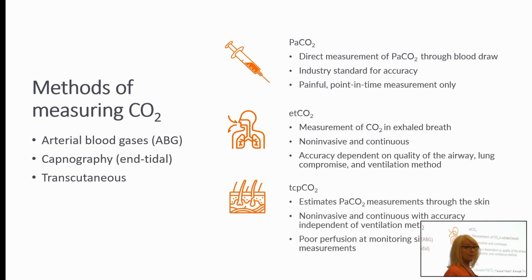Third, we have transcutaneous CO2 monitoring, and I'm going to talk about that, of course, in depth later. This is also non-invasive and continuous, like your end-tidal, but its accuracy is independent of your ventilation method and independent of any VQ mismatch you're getting in your patient's lungs. You've got to consider the perfusion at the site. Poor perfusion at the measuring site can impact your values. We are going to take a closer look at each one of these methods.